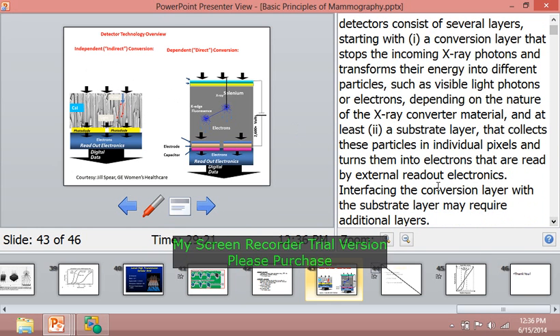So this is the same, the selenium X-rays, then we can have directly the digital data. And in indirect, first we need the photodiodes.